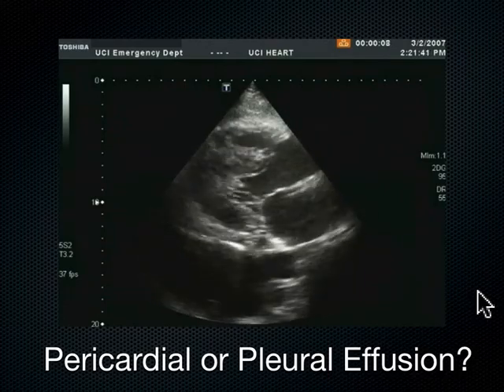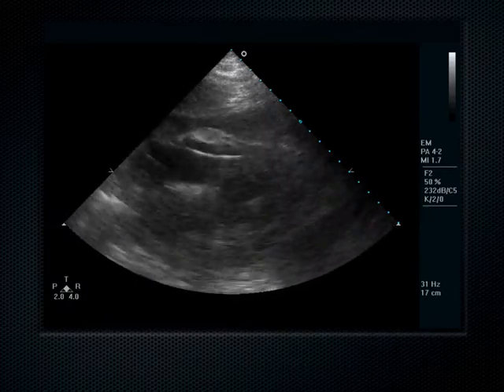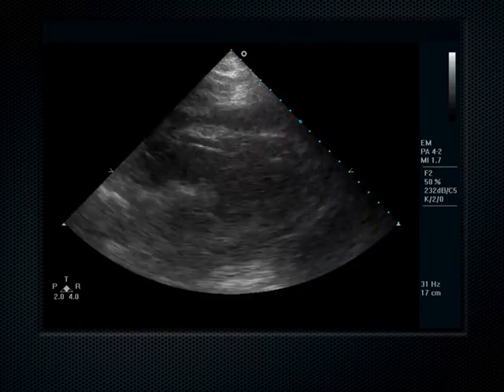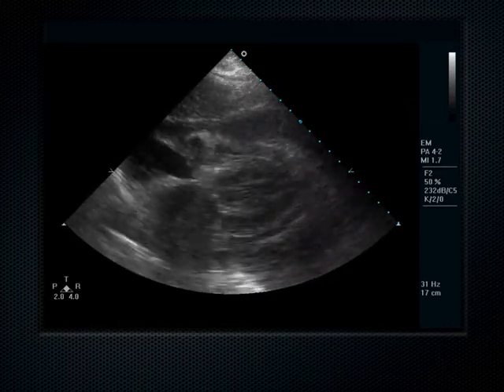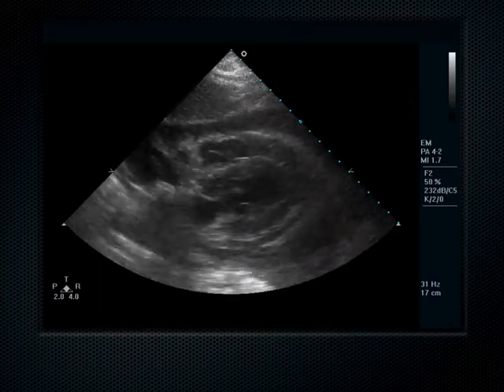I always do that. Yeah, the problem is when you get a gunshot wound to the chest and you could have both a pericardial effusion and a pleural effusion, then you're really stuck, because the pericardium can drain into the pleura. Yeah. Or it could have both of them. Tamponade could be your problem, or hemothorax could be your problem, or both. Yep, and then it's thoracotomy. Thoracotomy time, yeah.